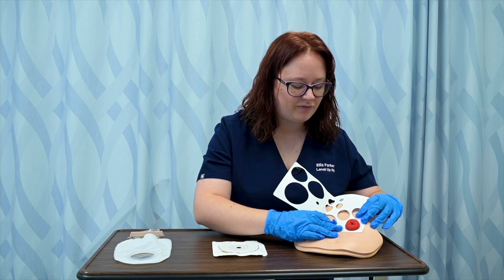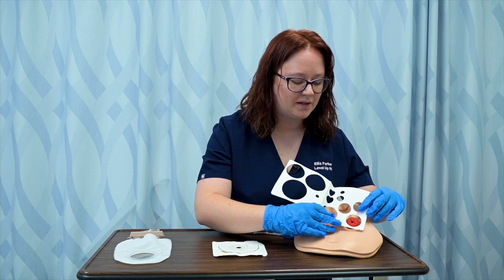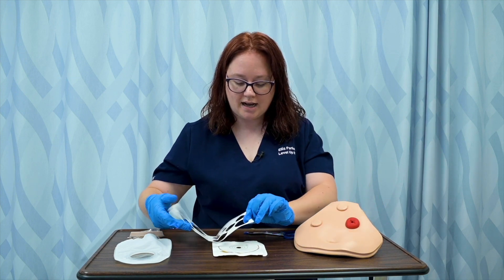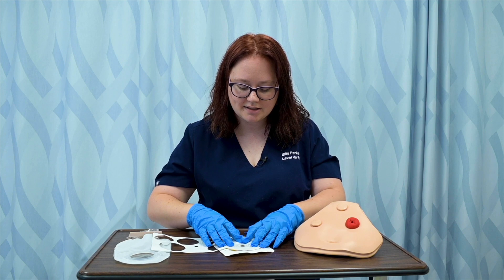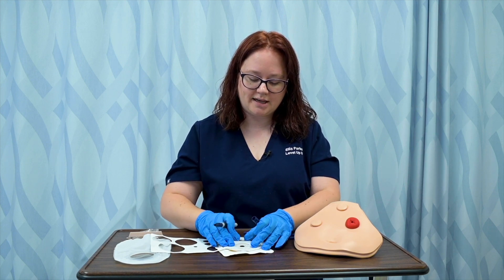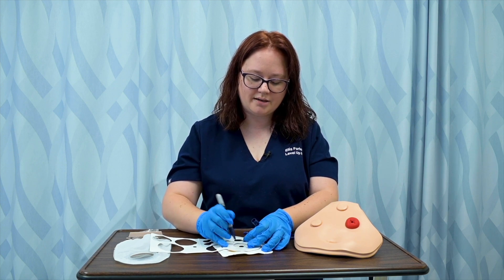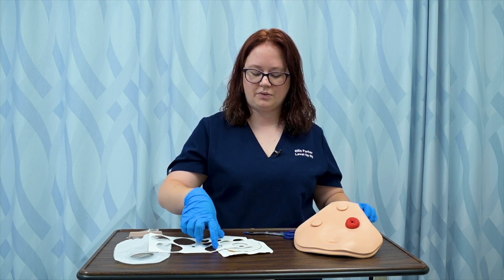You can see that it fits snugly — it's about one eighth of an inch around the ostomy stoma itself. So I'm going to use this as a guide to select the size on my ostomy wafer. There are lines that indicate it, but I'll go ahead and mark it just for my own comfort, making sure that I cut the right size out.